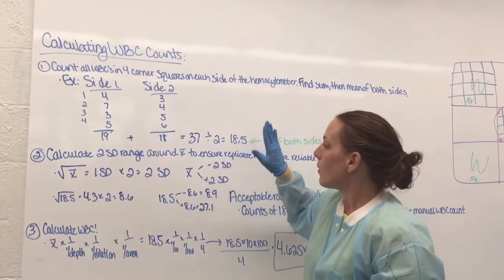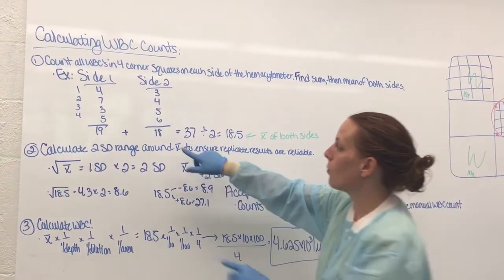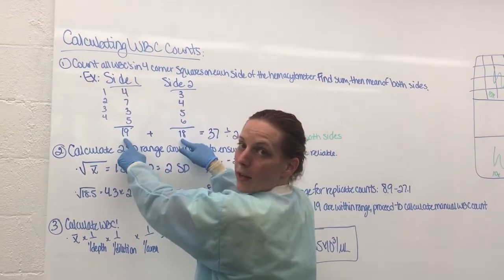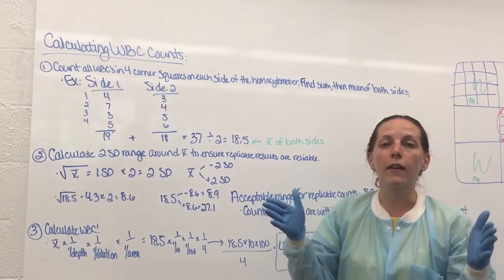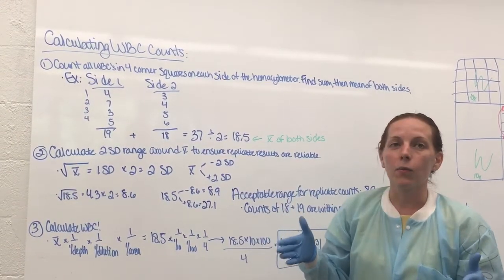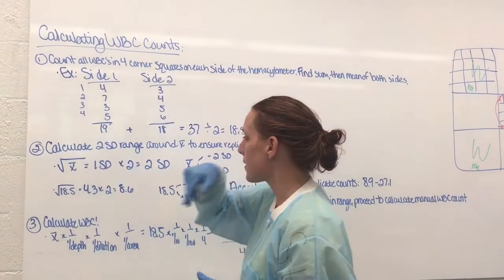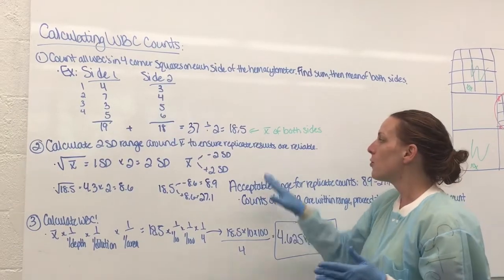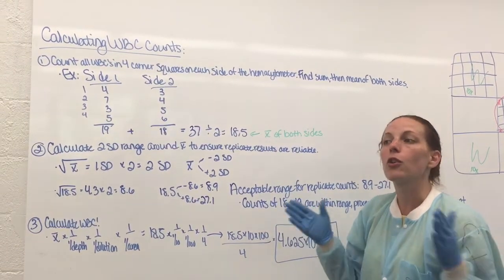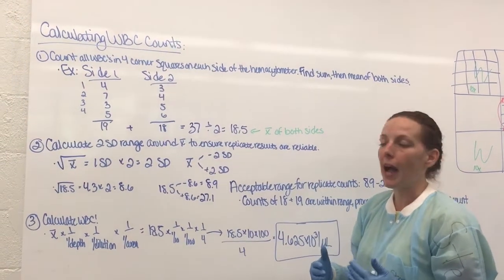So once we have a mean, the first thing we need to do is figure out whether these 2 replicate counts, our counts from side A and side B, were acceptable. Were they close enough to each other that we know that our result is accurate? And the way that we do that is to calculate our 2SD range around that mean to ensure that those replicate results are close enough to each other that our calculated WBC count will be accurate.